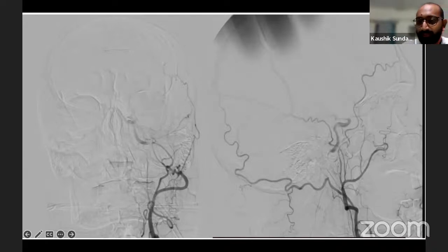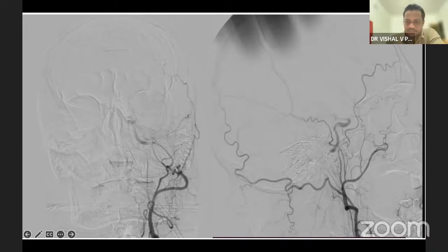Okay. So coming back to this. This tells you that this is a chronic lesion. Remember this: you don't have time to analyze so much. You're still thinking what to do. So sometimes when you allow the angiogram to run, not only will the contrast move distally in the carotid ICA, it will also come down to the proximal segment to give you an idea of where the clot is.